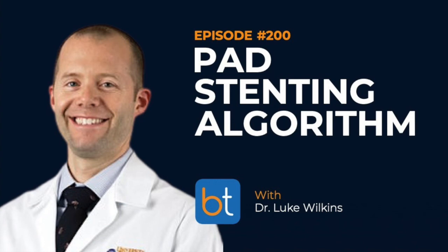Let's do it. One important point for anyone looking to tackle chronic total occlusions, besides having a reentry device or two that you can use relatively frequently and that you're comfortable with, is also having strategies for when those devices fail, because it is not infrequent that you are unable to enter the true lumen and all your reentry devices fail. You need another trick up your sleeve. For most people, that secondary trick is doing a SAFARI. SAFARI stands for subintimal arterial flossing with antegrade retrograde intervention.